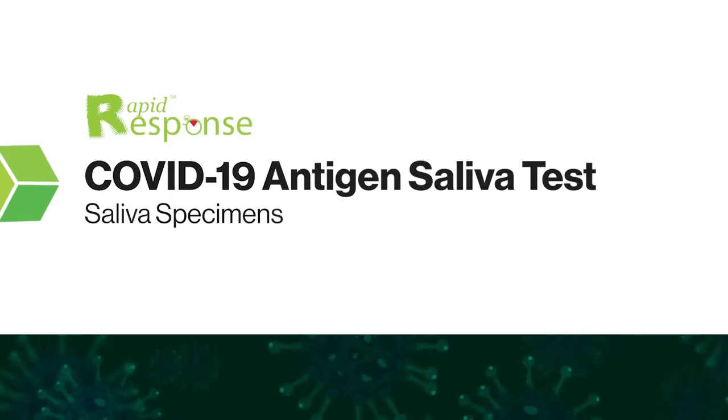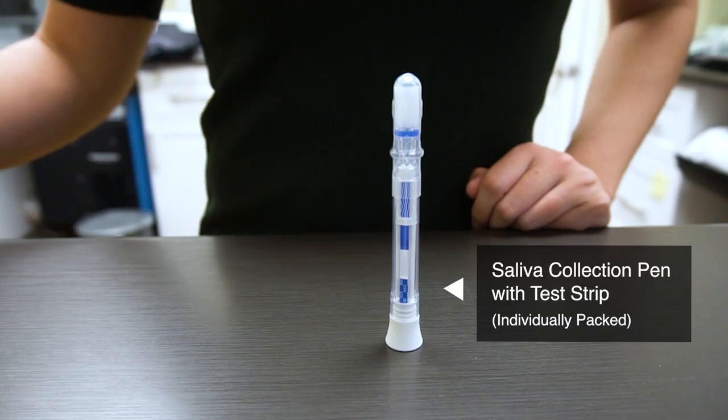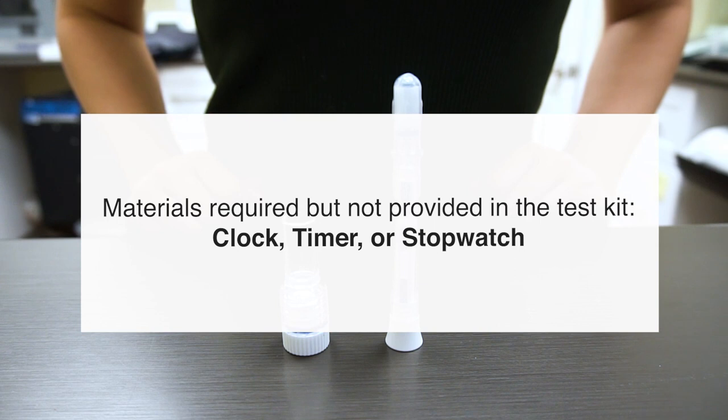This is a demonstration of how to perform a rapid response COVID-19 antigen saliva test. The test kit provides a saliva collection pen with test strip and an extraction buffer cap. Materials required but not provided in the test kit include a clock, timer, or stopwatch.